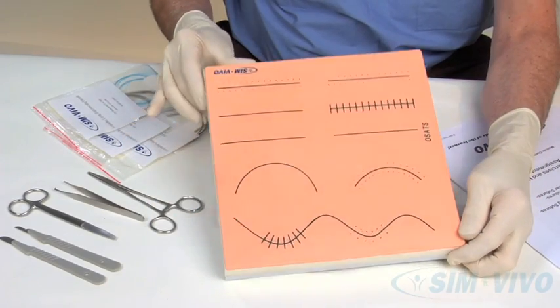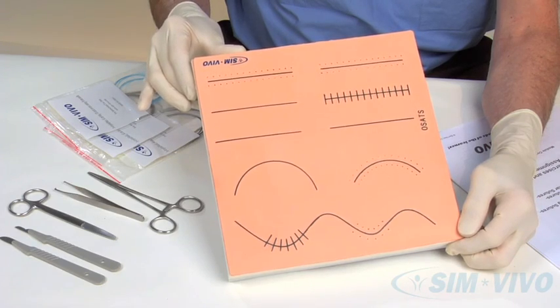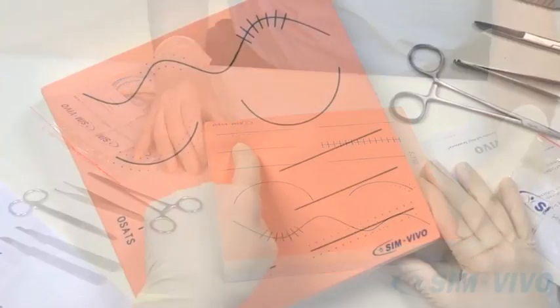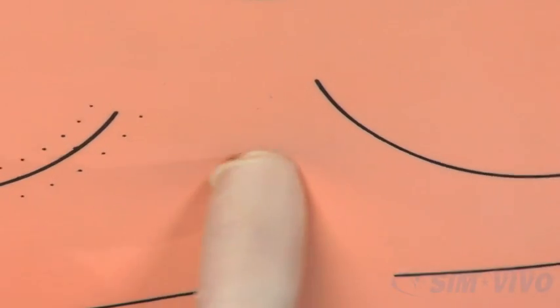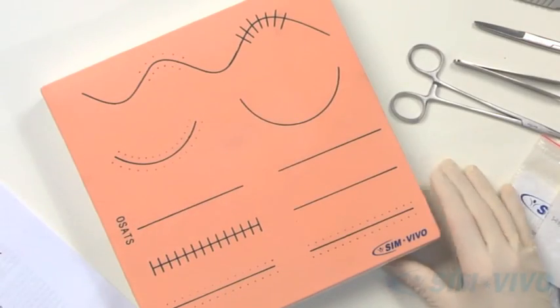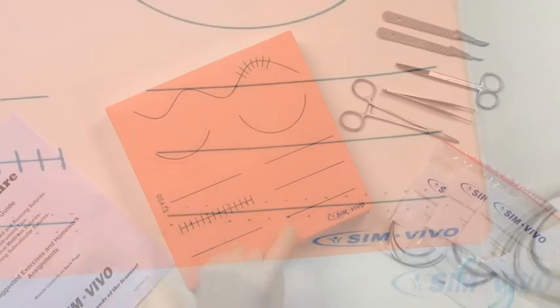This is the Suture Practice Board. It has been designed to resemble skin sufficiently to allow a realistic suturing experience. The outer layer is loosely adhered to the foam by a layer of areolar material that simulates subcutaneous tissue. Imprinted lines are available to guide your practice.